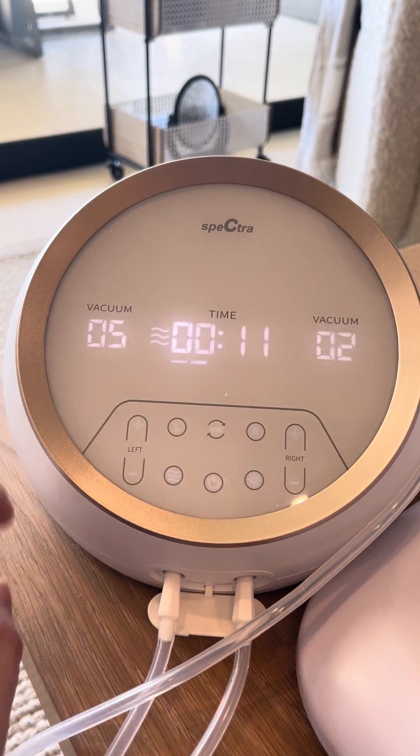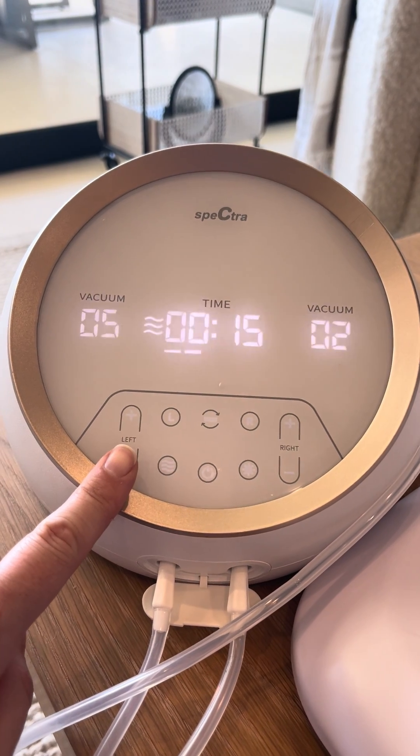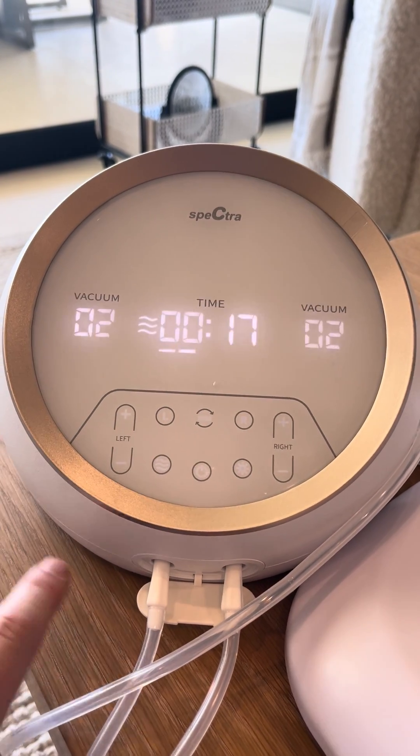If it's too soft, turn it up. If it's too hard — don't suck your brains out your nipples — turn it down.